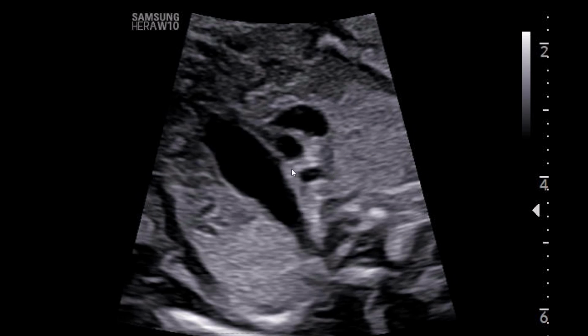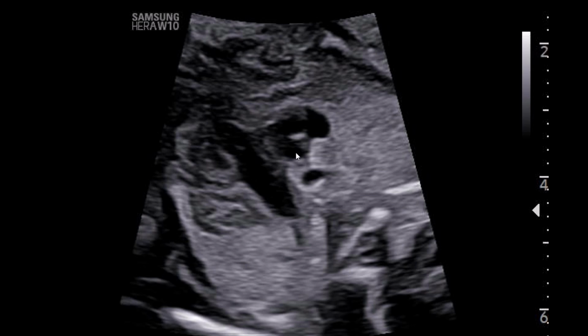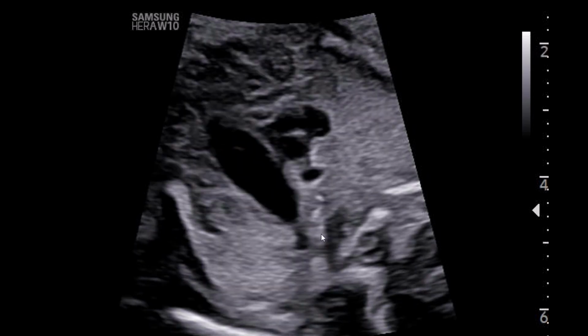Either the ascending aorta will go to the left of the trachea and connect with the ductal arch here and create this V appearance, or the aorta will go to the right of the trachea in the course of right-sided aortic arch and connect with the ductal arch back here, creating a U shape. And so either way, the aorta should connect with the ductal arch.